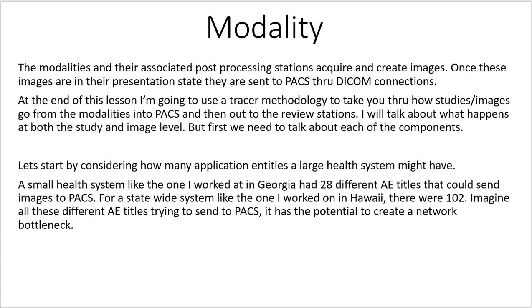The modalities and their associated post-processing stations acquire and create images. Once these images are in their presentation state, they are sent to PACS through DICOM connections. At the end of this lesson, I'm going to use a tracer methodology to take you through how studies and images go from the modalities into PACS and then out to the review stations. I will talk about what happens at both the study and image level, but first we need to talk about each of the components.